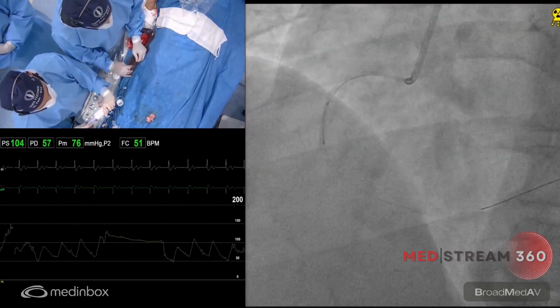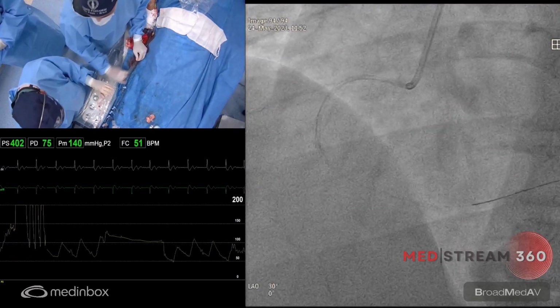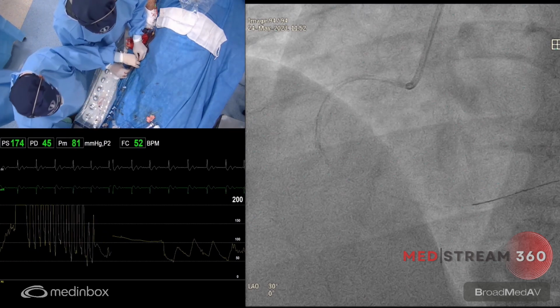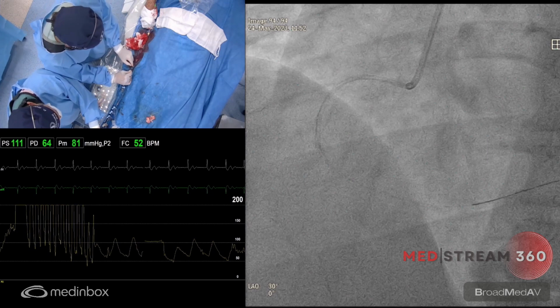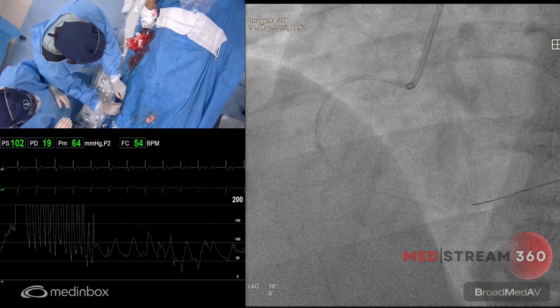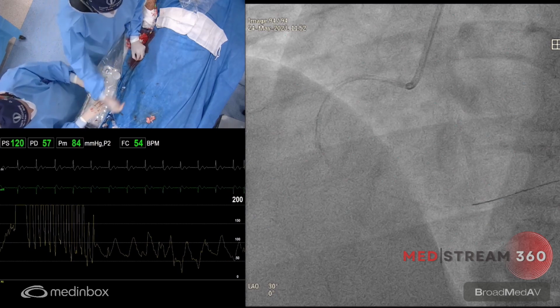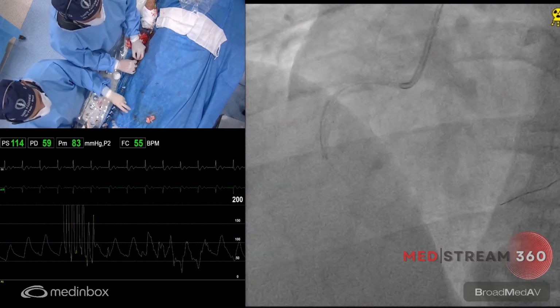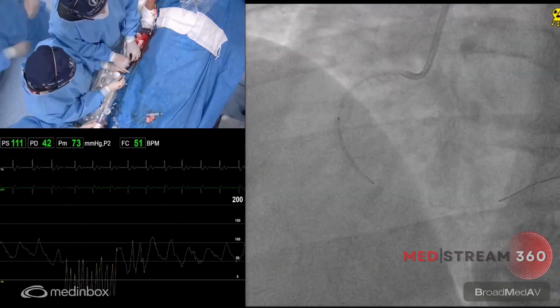So doesn't it work with IVL now? No, the stent. Okay, we are going to be finishing in 5 minutes now with the mother and child catheter. This is from Terumo. What's the name of this one? It's the ST01. Okay.